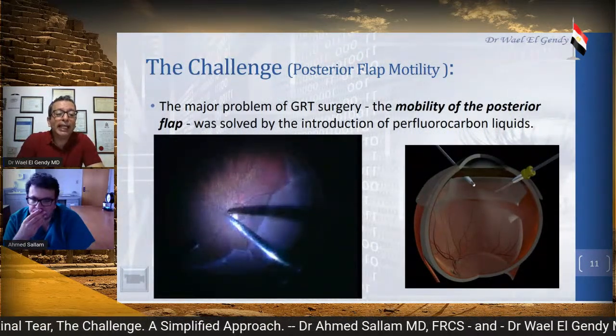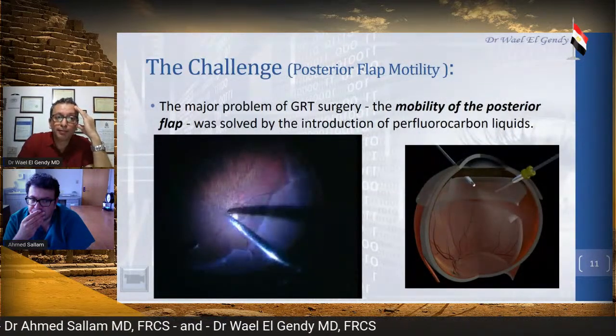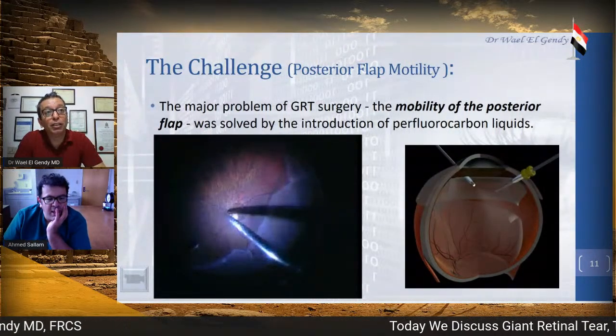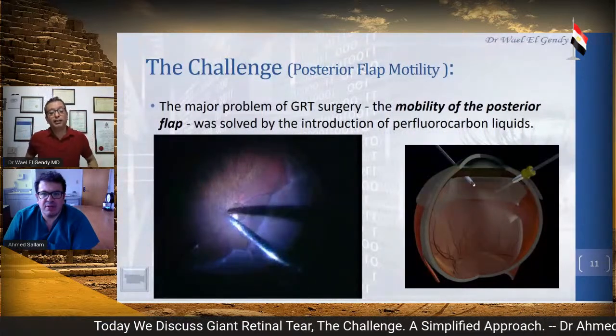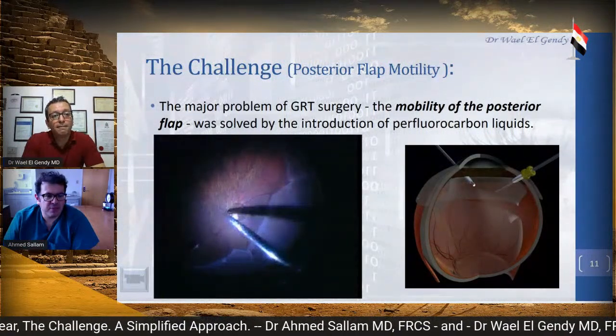Okay. Do you have any hints about the injection of PFCL? About the injection of PFCL? Yes, during the injection of PFCL. Yes, I can actually show a video. Okay, please do that. Let me just get my.